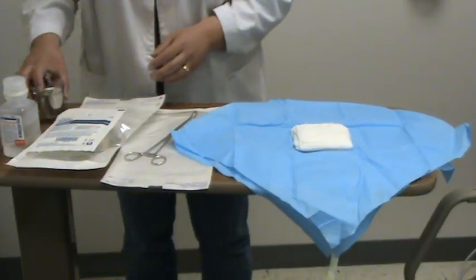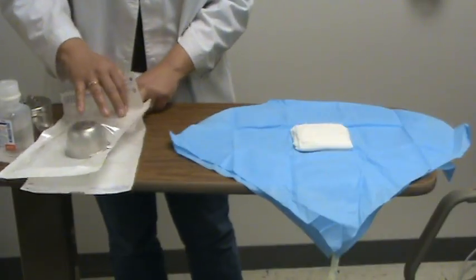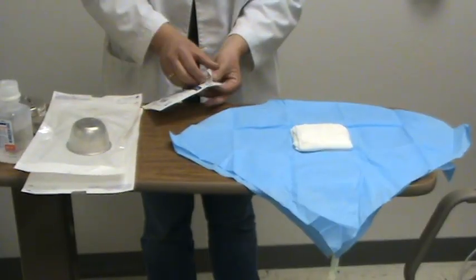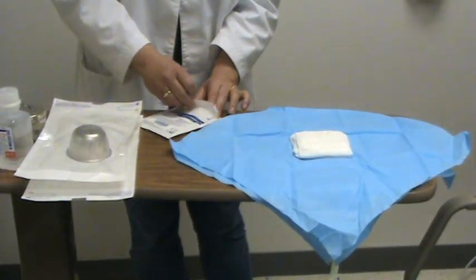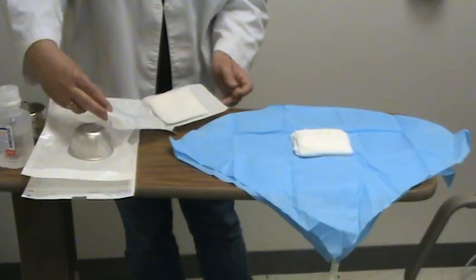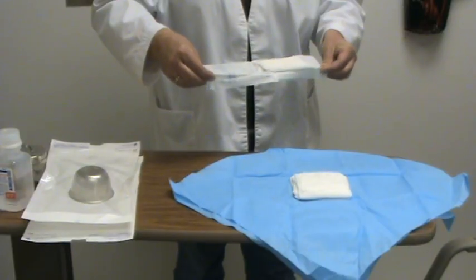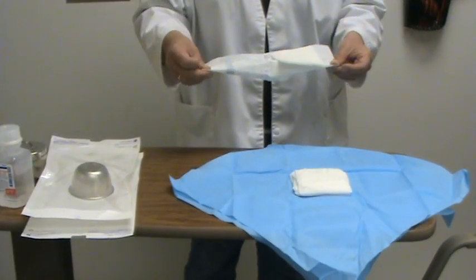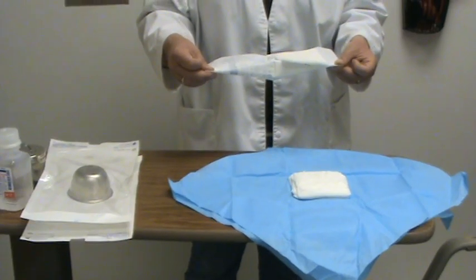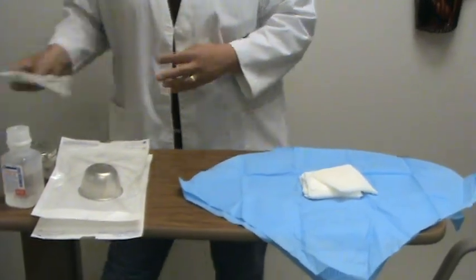The next thing I'm going to do is add a 4x4. I'm going to open my 4x4s. I don't want to work over my field, so I bring the package underneath — that way my 4x4 doesn't slide across and get contaminated. Then all you want to do is come in from the side and plop it on.